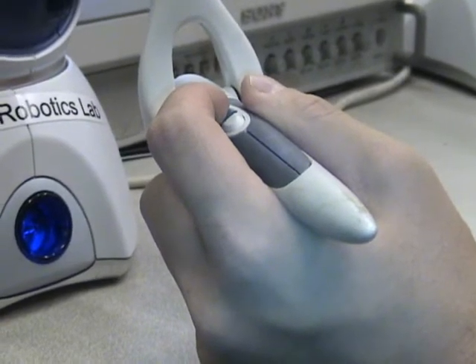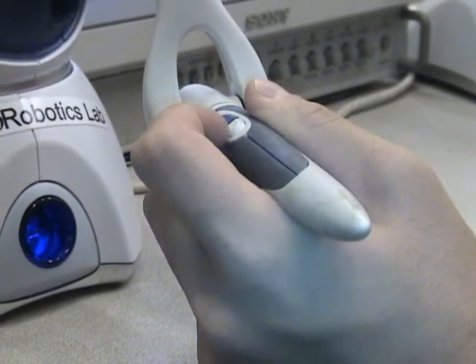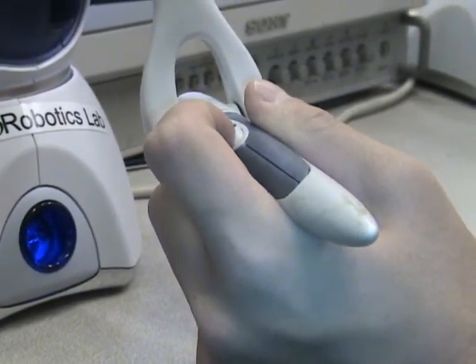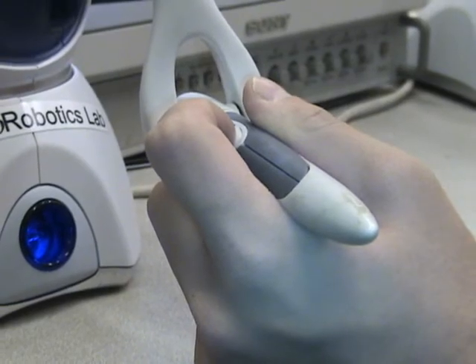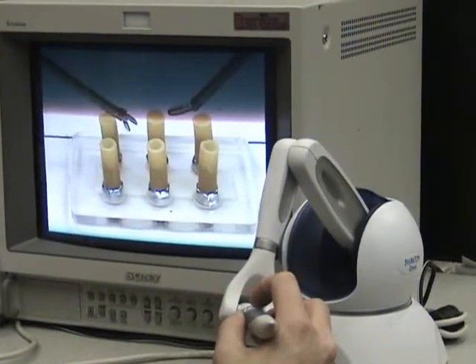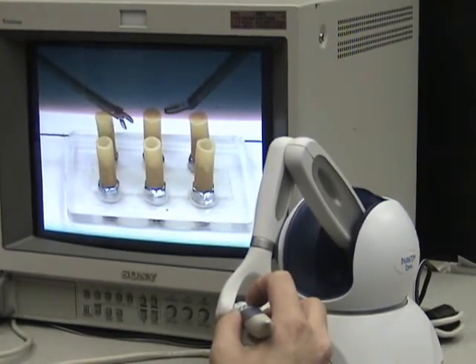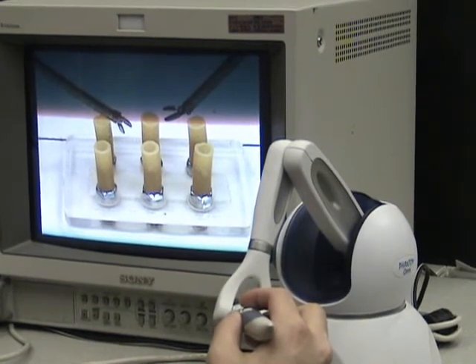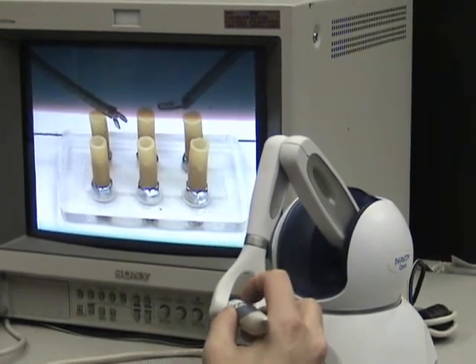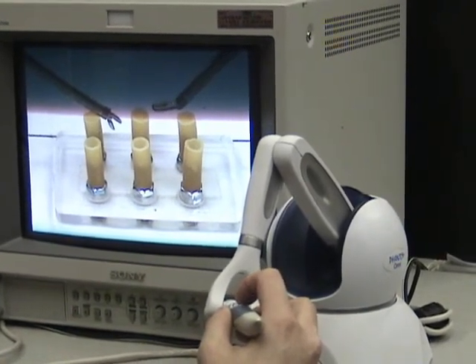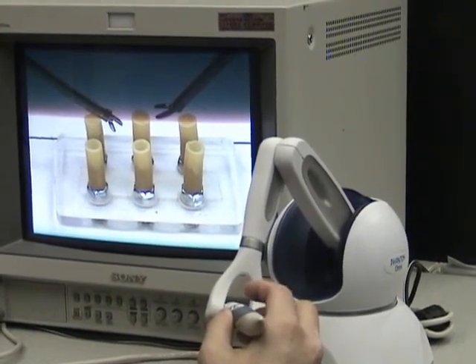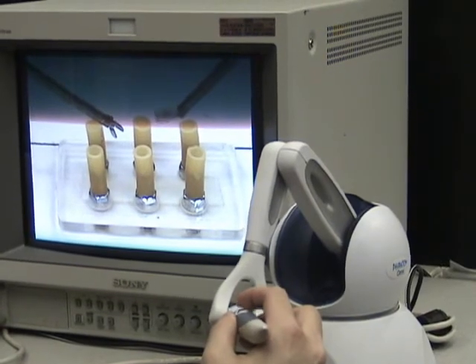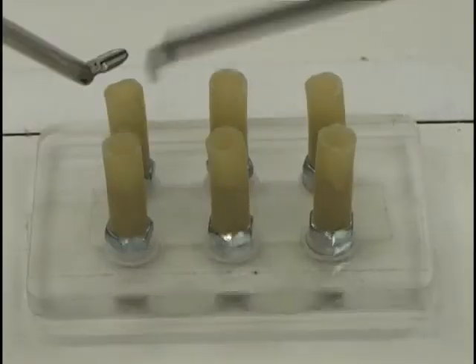To close the grasper, press the blue button. To open, press the white button. As you move through the workspace, the grasper jaws may become closed. In order to reopen the jaws, grasp by pressing the blue button, then ungrasp by pressing the white button.